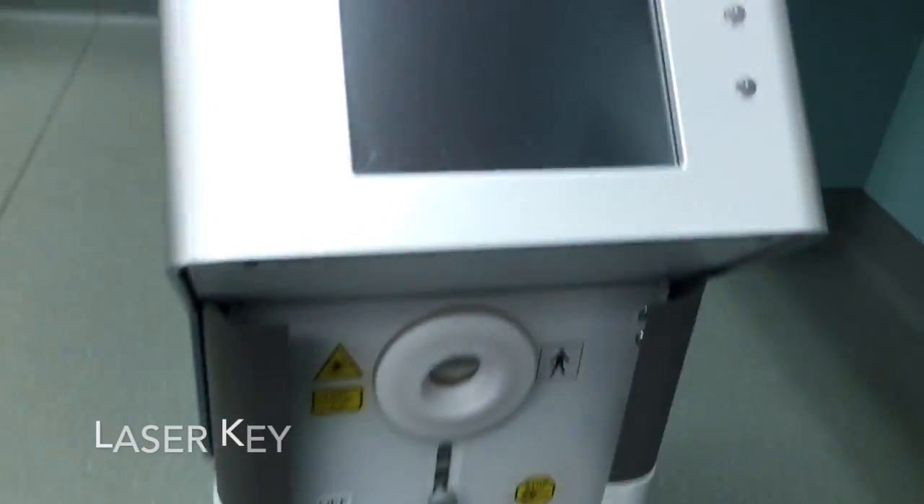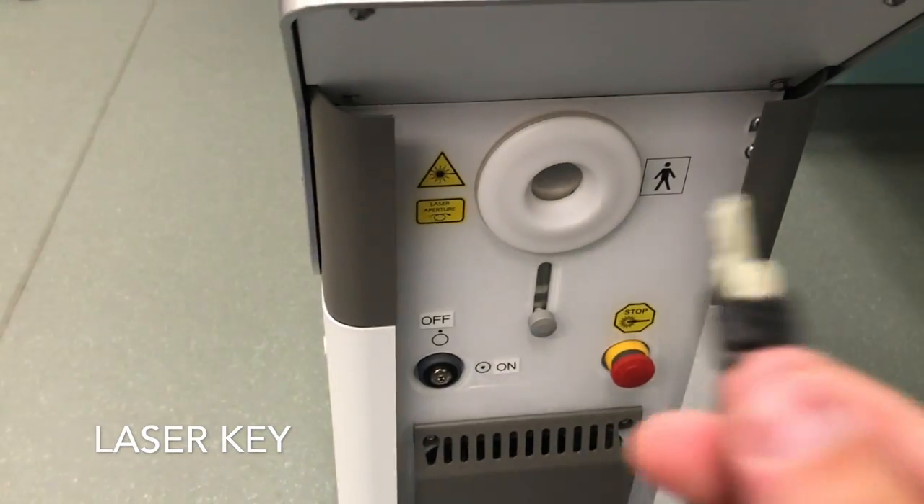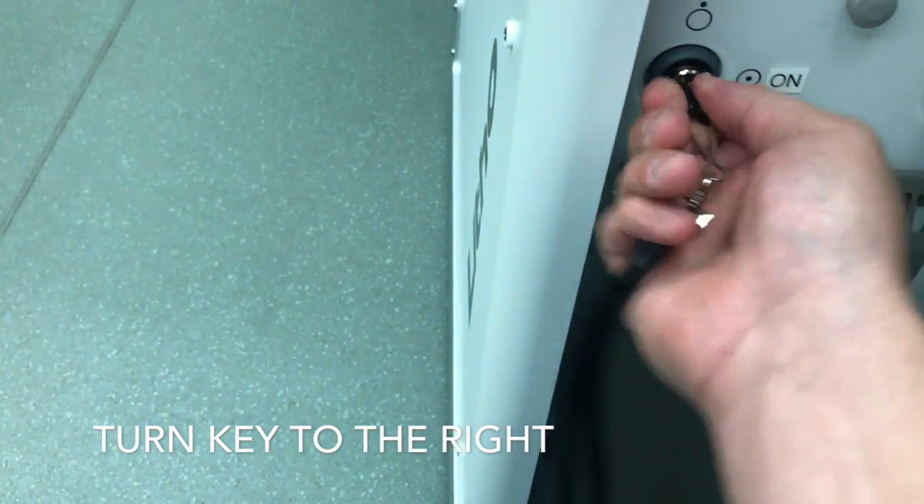The plug for the foot pedal — take the foot pedal plug, which has a little notch at six o'clock, plug it in, and then tighten it down.